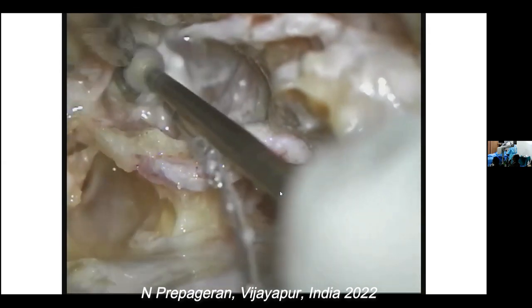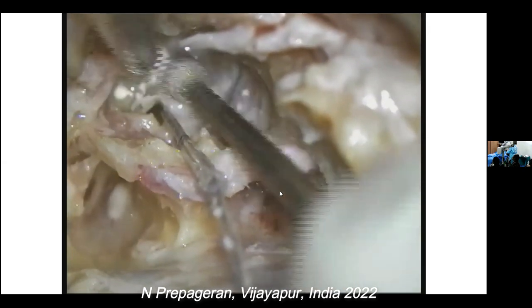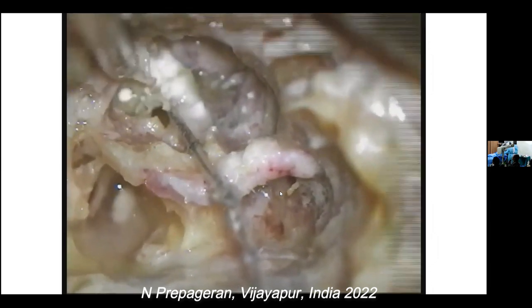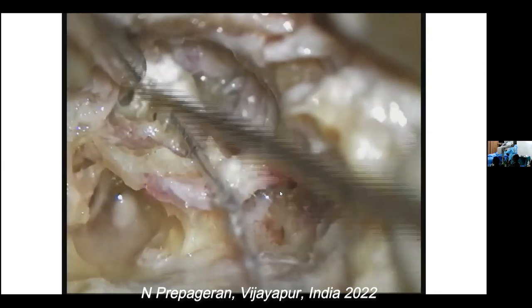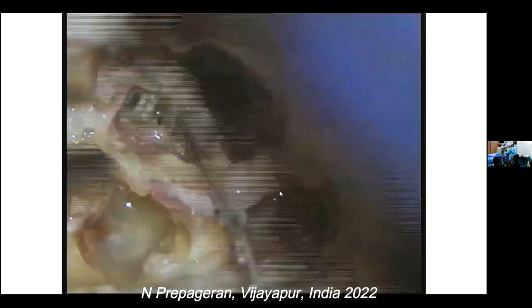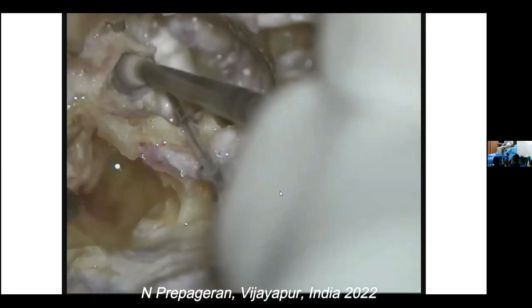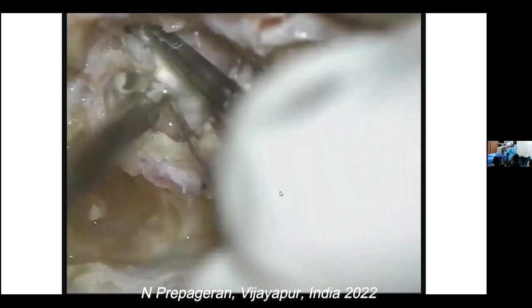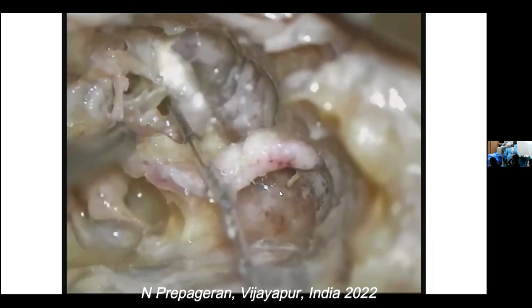Let's drill the second turn. Give me a pick again, and see whether we can follow. Yeah. That's the second turn. Okay. This is the spiral, the osseous spiral lamina. Let's go. Second turn, guys, can you see? That's the second turn of the snail.